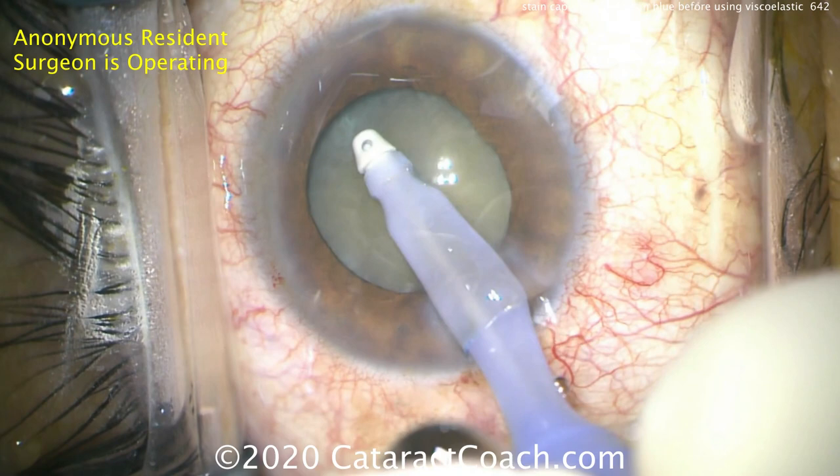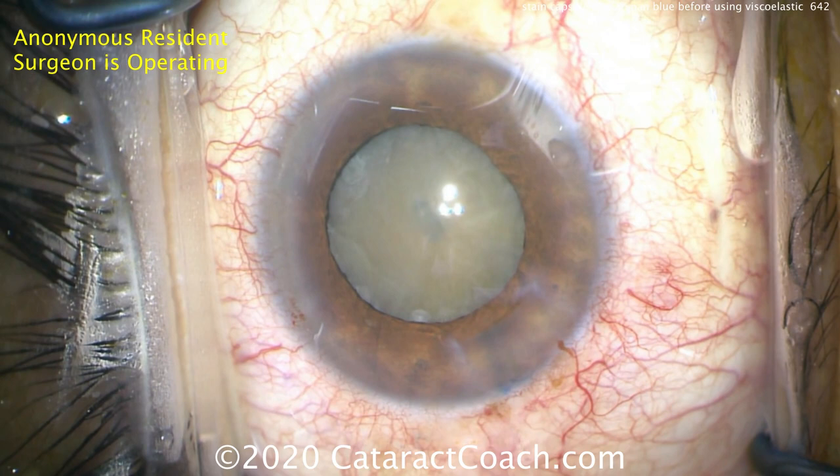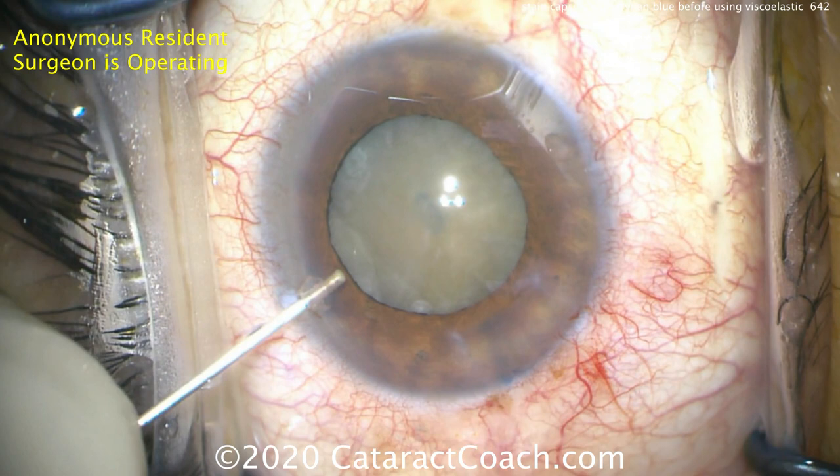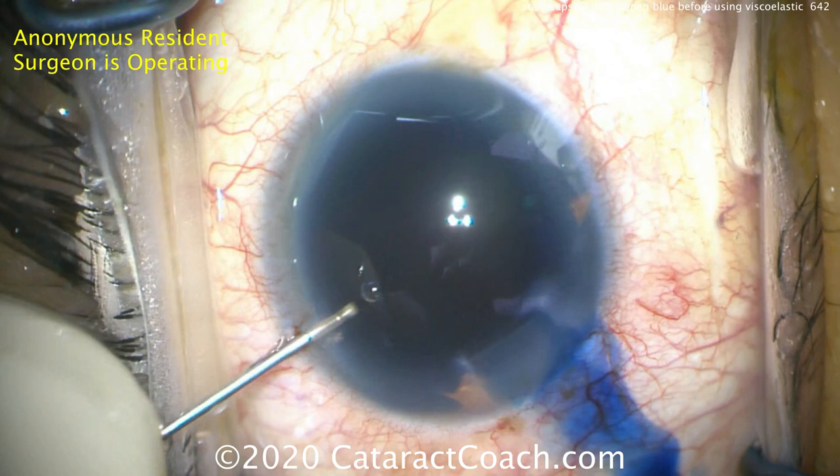Let go of that iris there for a second — you don't want to make the pupil any smaller and make your surgery more challenging. Nice removal of viscoelastic. Now the TriPan Blue Dye can be instilled in the eye. Go ahead and fill the eye up with the blue dye. Now you'll have direct contact of the blue dye with the anterior lens capsule, so for sure it'll stain.